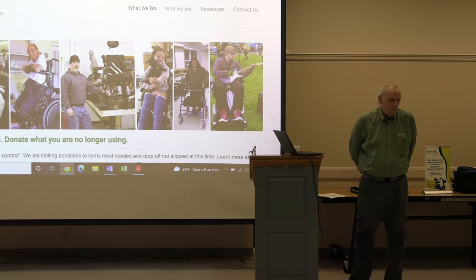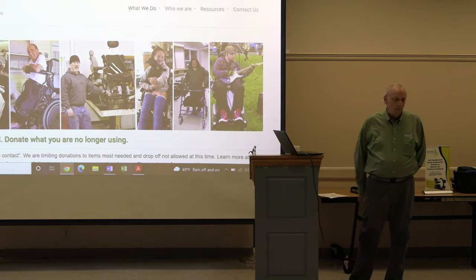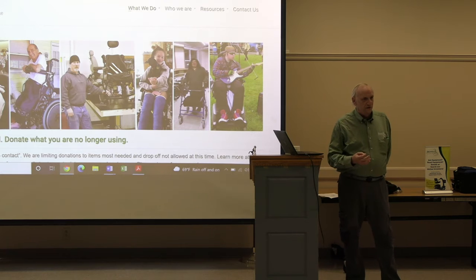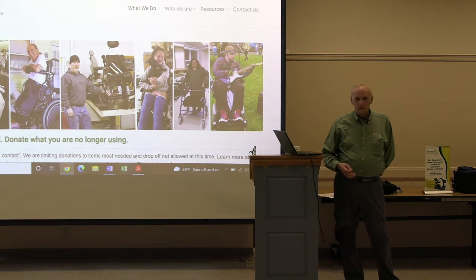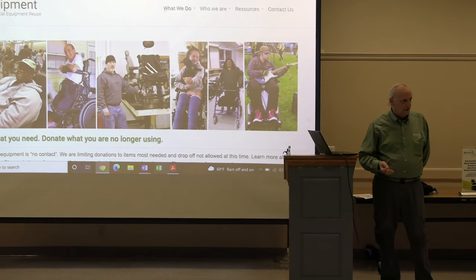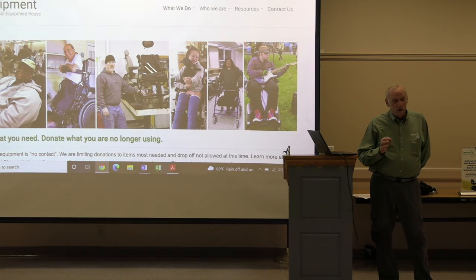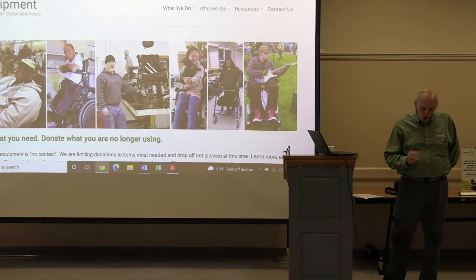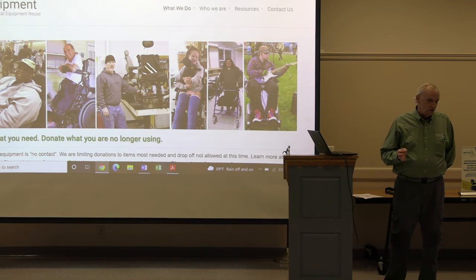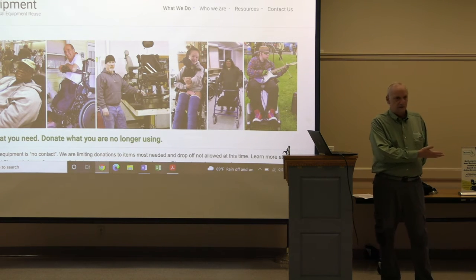Because frankly, Medicare doesn't pay enough for a company to go out and repair the chair. Most companies now will only repair chairs that they have provided. So if you got your power chair through one of the major companies, 2 years later you have some problems, they may come out and fix it and bill insurance. The problem with that is you can look forward to quite probably a 3-month waiting period, a 6-month waiting period, and especially now since COVID, I've been hearing all kinds of stuff about the parts being stuck in a port in California.